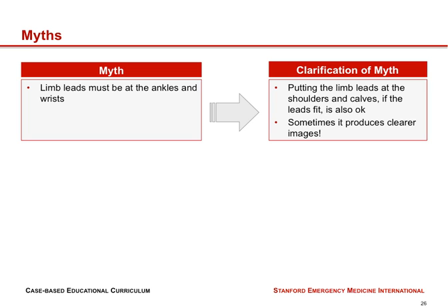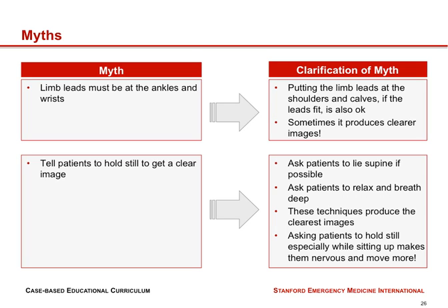See what works best with your machine. Finally, there is a myth that if you tell patients in a command form that they must hold still, you will get the clearest image. That may work for some patients, but for other patients, telling them to hold still can make them very nervous and, in fact, interfere with your ability to get a clear ECG. When patients are moving too much, ECG lines are very unclear. They're very wavy. You get artificial waves on the ECG, not the PQRST, but other waves simply created by the movement of the patient themselves physically.